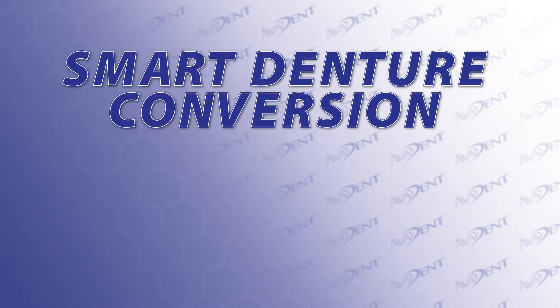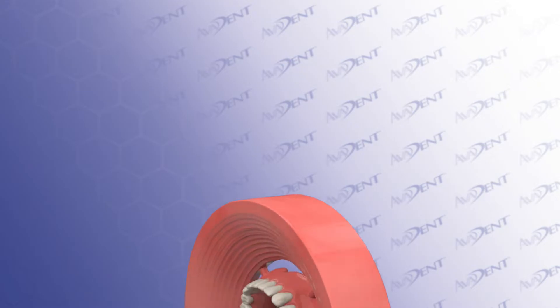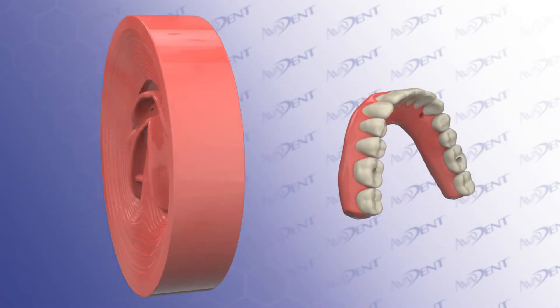In this tutorial, we will be discussing the Smart Denture Conversions Protocol for converting a removable AvaDent monolithic denture into a fixed complete denture on multi-unit abutments.